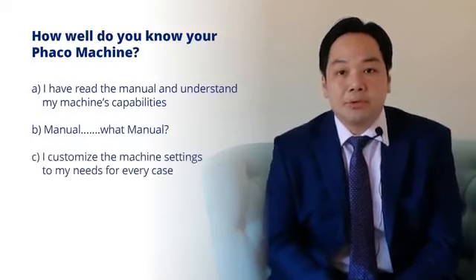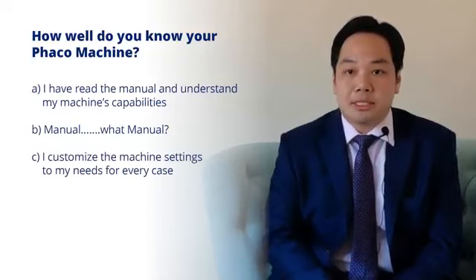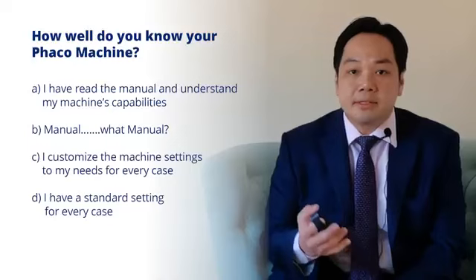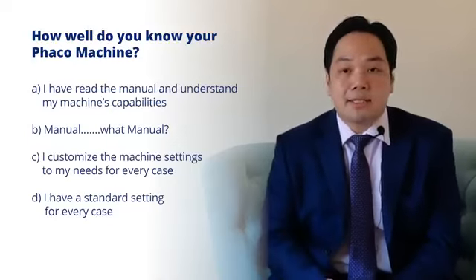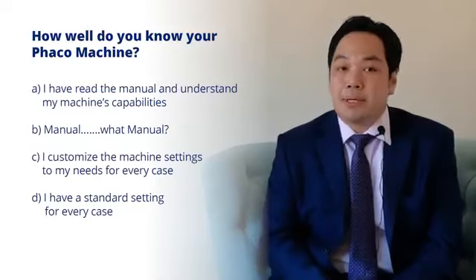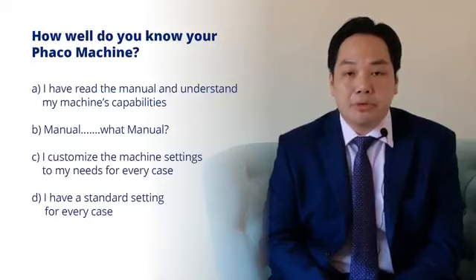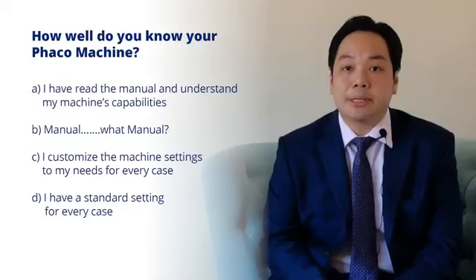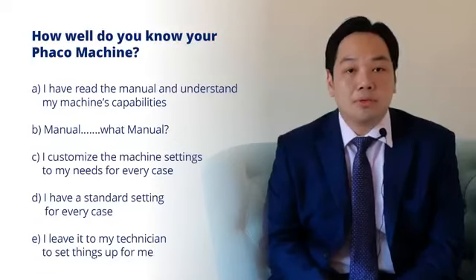And really it's important because you need to customize your machine settings, and whether we are doing it actually, we don't know. Some people have a standard setting for every case, and that perhaps may not be a bad idea, but really when you move on to the more complex cases, you probably need to actually customize. And a lot of people also leave it to the technicians.